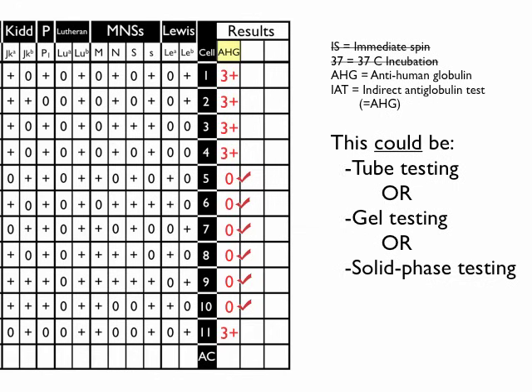But the check cells basically indicate that this is liquid testing, that when you had a negative anti-human globulin test, you've gone on and done a Coombs control, as it's called, and it's turned up positive, showing you that you did your reactions properly, or you did your mixtures properly, basically. You see that, you've got tube testing. So that clinches it for you. If you don't see that, and you don't see anything else at the bottom, then typically that'll commonly be gel testing. It's not always by any means, but it certainly is likely to be gel testing in that scenario.